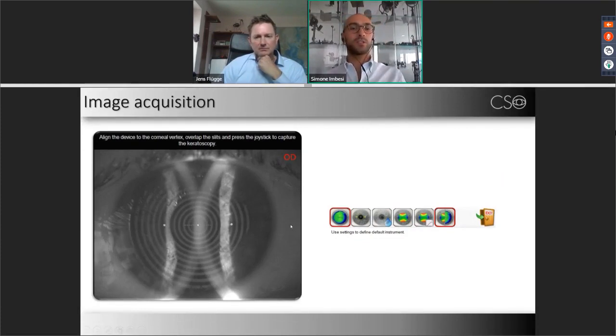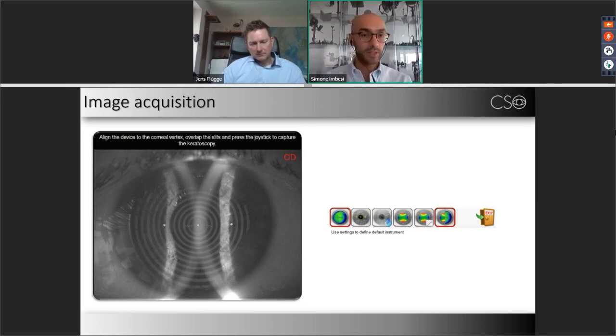The first thing is the correct focusing of the system, because as I told you before, one of the things that we have to know to apply the ArcStep algorithm was to have a known operating distance.